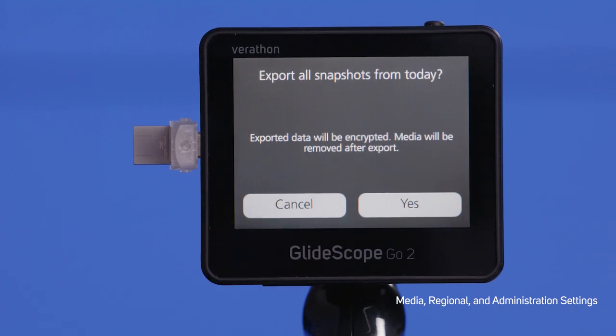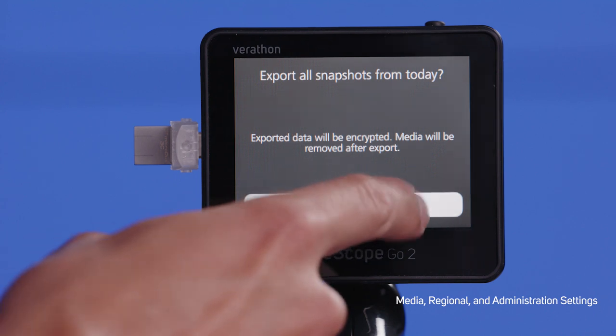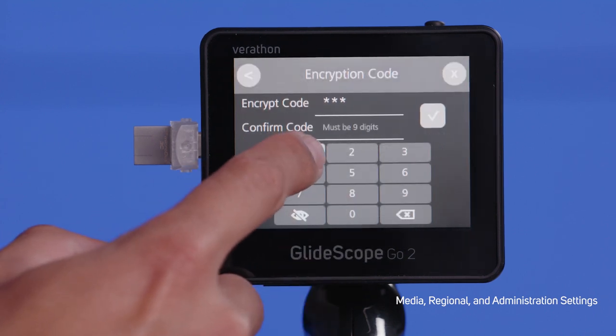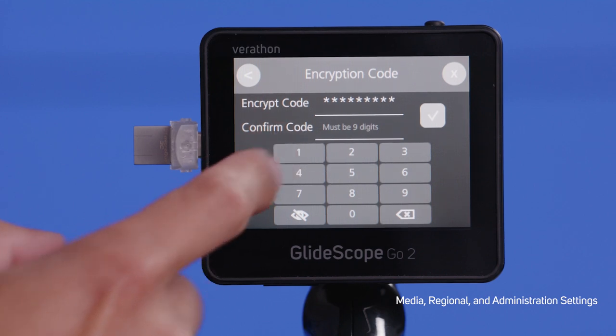Click Export while encryption is toggled on, and you will be prompted to input a 9-digit encryption code. Once you do this, your export will begin. To view the exported media on your computer, run the decryption file. Your input folder is your USB-C drive, and your output folder is where you want the media to go. Type in your encryption password and click Decrypt.